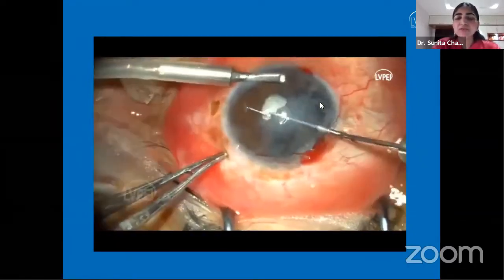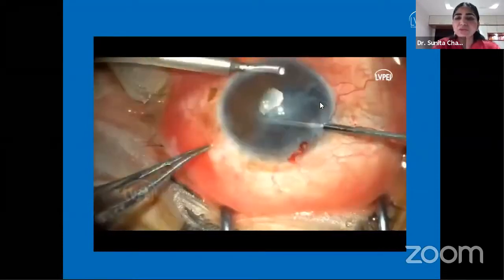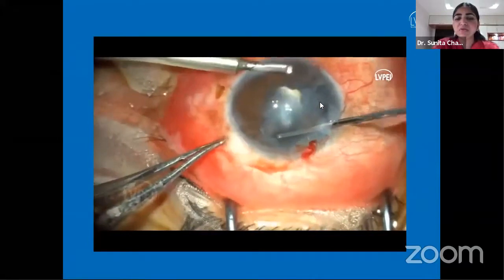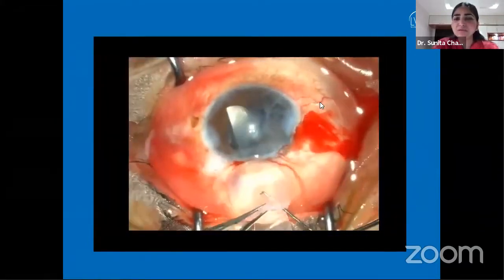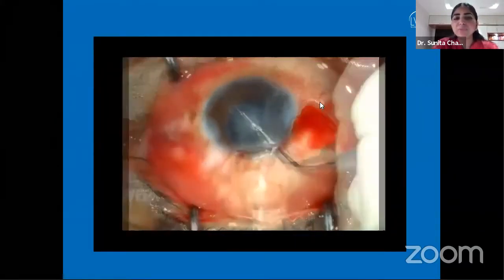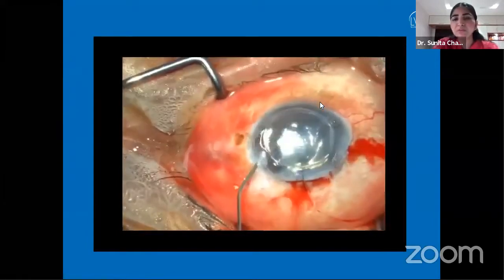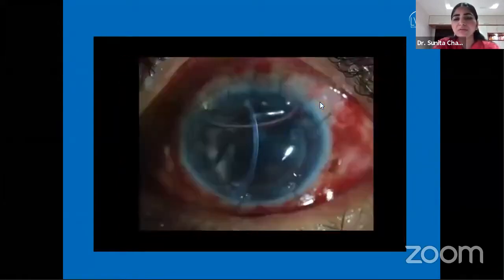And in this particular case, there was also communication with the posterior chamber. There was an intraocular lens, and that is where it was communicating. So a limited area was cleared in the posterior chamber, followed by, in this particular case, we have just trimmed the sheath well because it was a little wider. In a similar way, just make sure that all side ports are watertight.